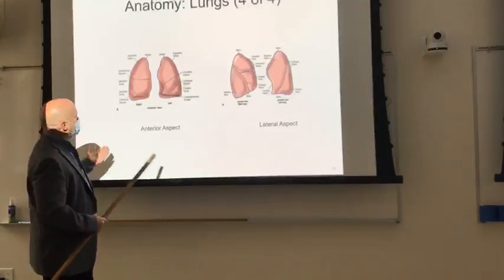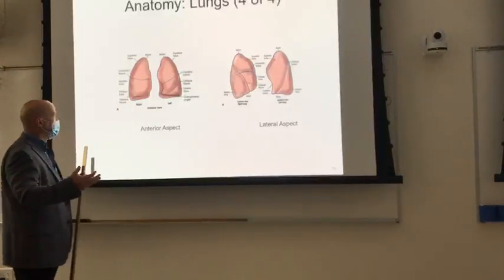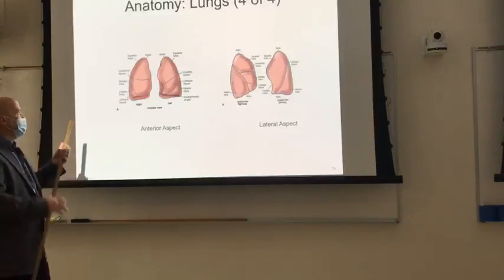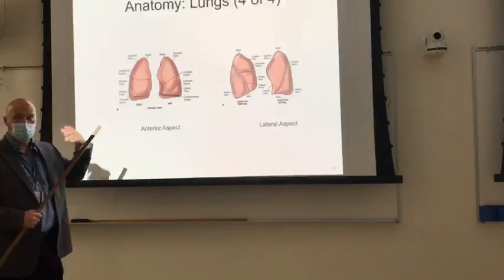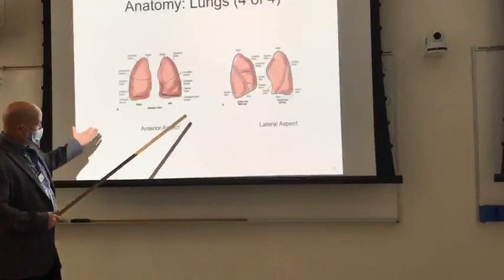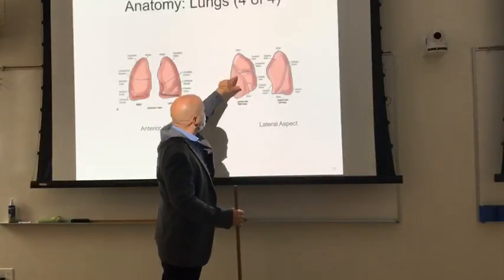No. We can't tell if it is in the middle of the inferior lobe, the upper portion of the middle lobe, or the lower portion of the superior lobe, right? But if we take that image, it's way back here, and then maybe it shows up way back here on this particular image.